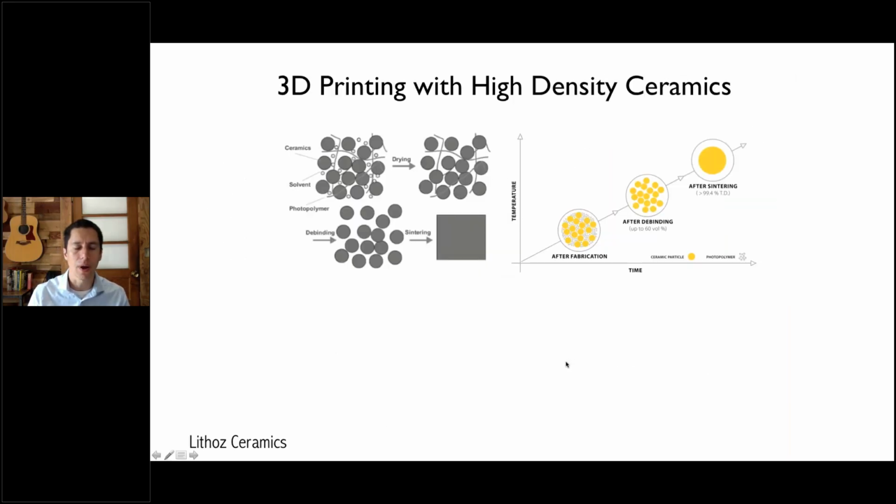So I wanted to jump into a different format, and that's the question that I get the most when I'm presenting about these printed polymers and plastic-based materials. What about ceramics? That's essentially what a lot of the clinicians are interested in, especially the prosthodontists. And the truth is that at the moment, we can actually 3D print high-density ceramics that have very high mechanical properties, comparable to what we find out there for conventionally treated ceramics.